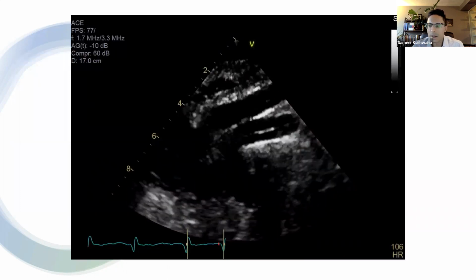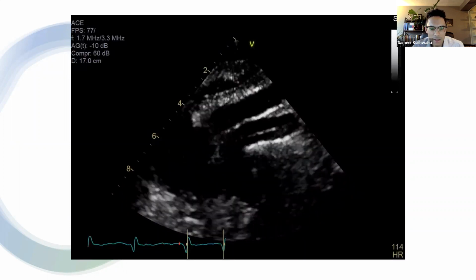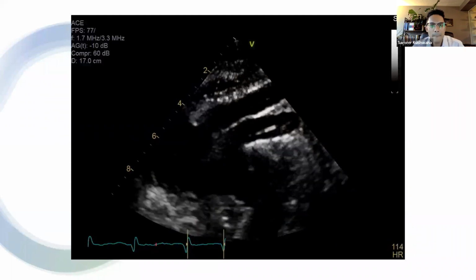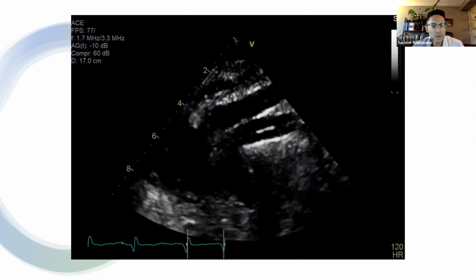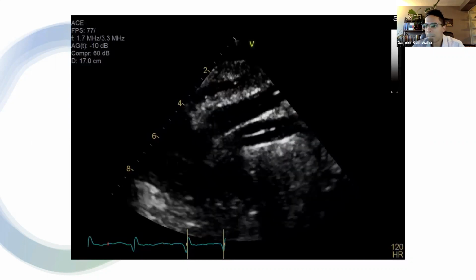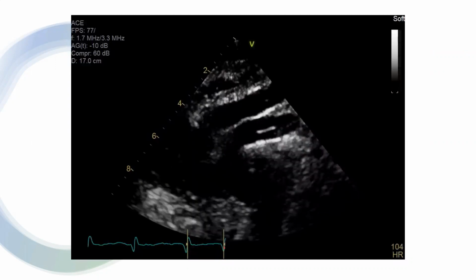Okay, so this is our next case. I don't know if any of the cardiology residents want to take a stab at it. And if not, I will talk in 10 seconds. Okay, I'll just go over it. So this one came into the lab earlier this week, actually. I can do it. I can do it.